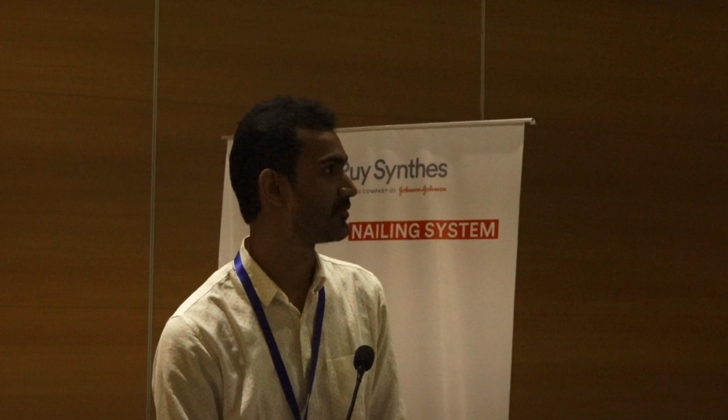So this is the post-op day 2 X-ray, very good X-ray with good cement hold, and the patient was mobilized from day 2 assisted with walker, and she has absolutely no pain. And this is the post-op 3 months X-ray. The blade is holding good, the cement is in position, and the fracture has healed very well, and the patient is absolutely pain-free.